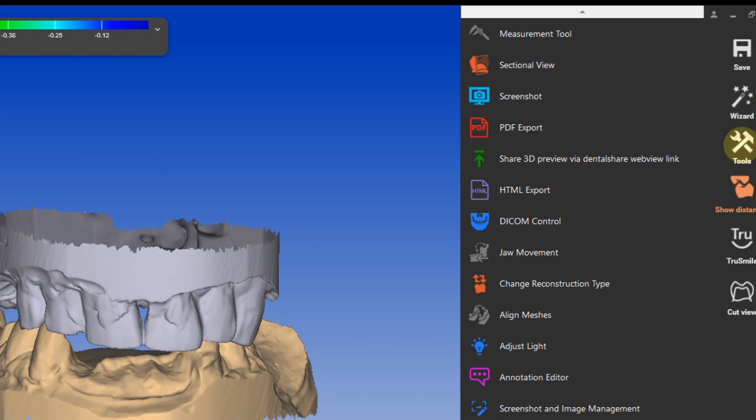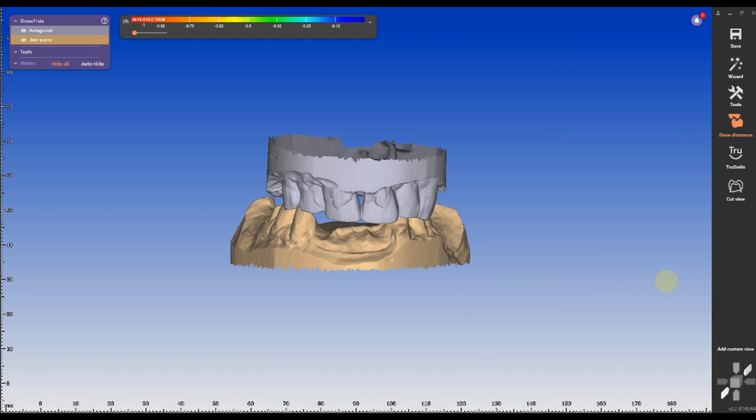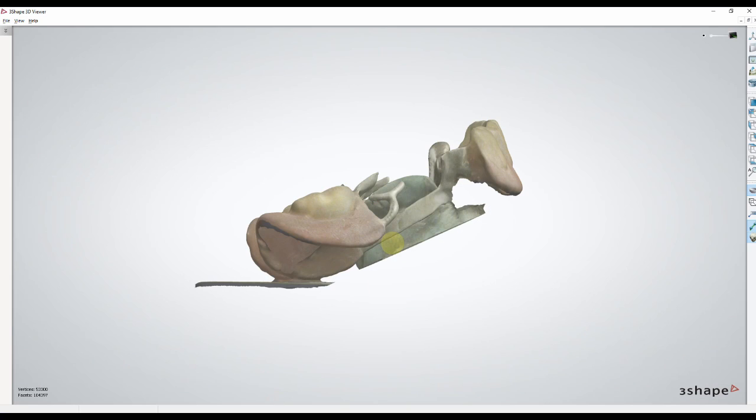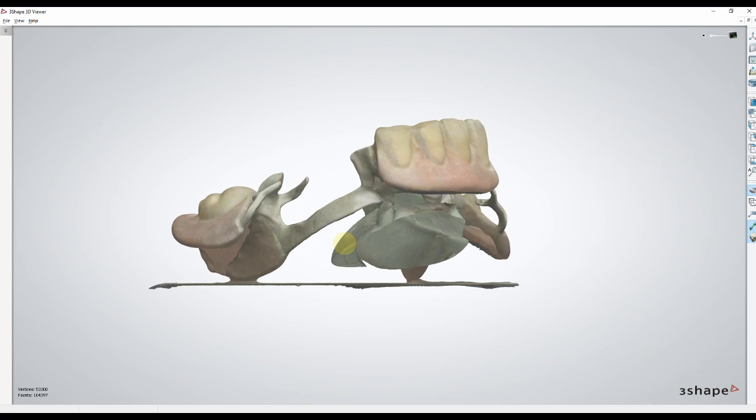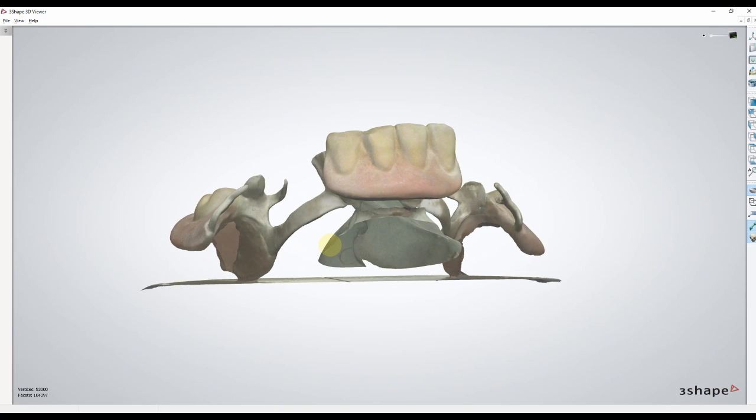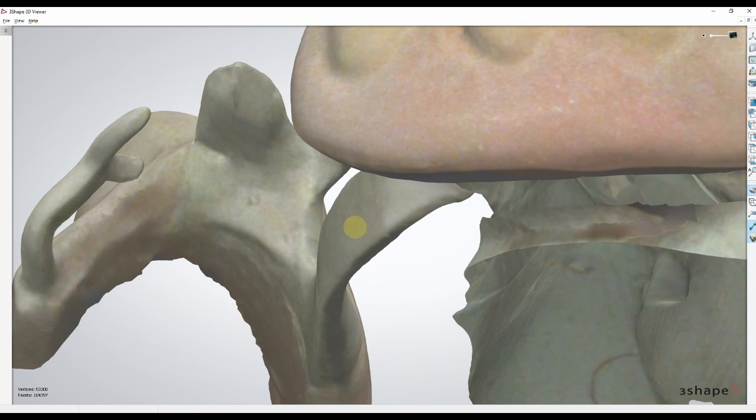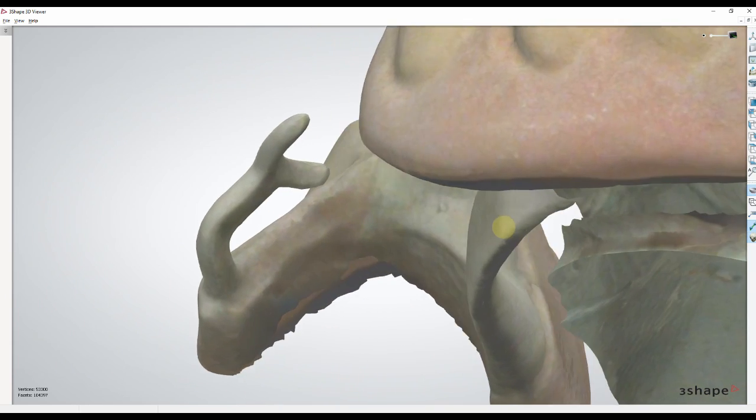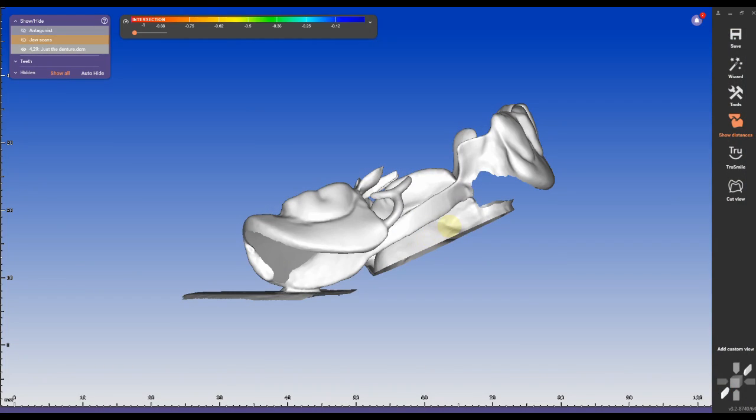Today I'm going to show you two ways how to create a crown under a partial digitally. One of the most important parts is to scan in the partial correctly. I recommend positioning the partial at a 45 degree angle on the scanning plate to avoid any holes or artifacts.